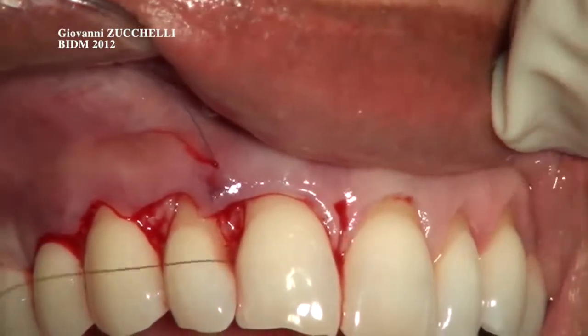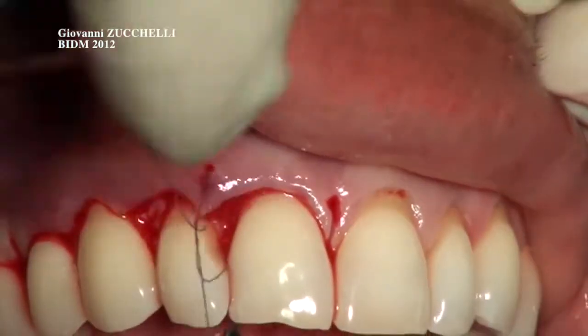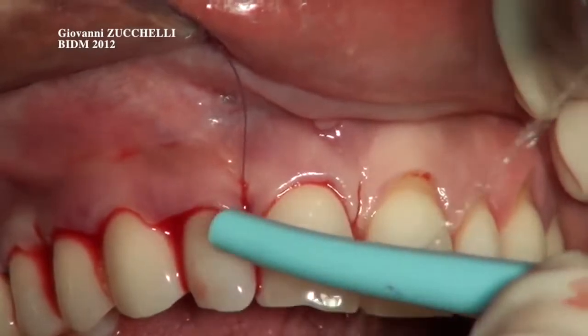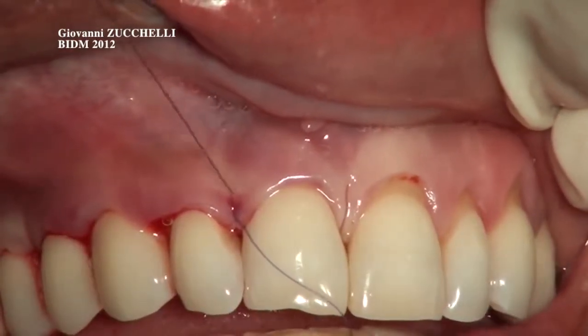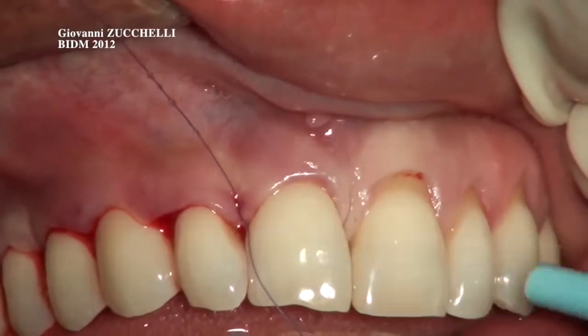So perforation is only made when you go from the buccal to the palatal aspect and never from the palatal to the buccal aspect. And now you make this papilla rotated in order to achieve the complete coverage of the surgical papilla above the anatomic papilla, and at the same time completely cover the central incisor.